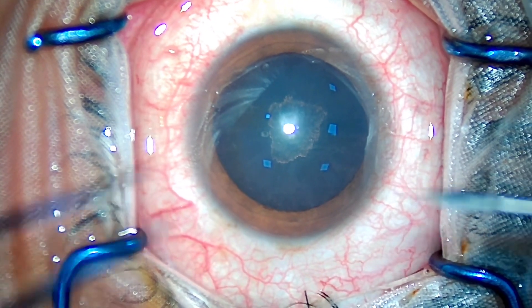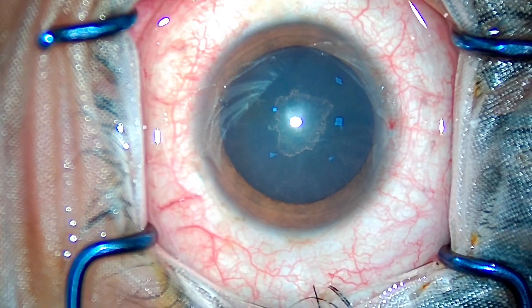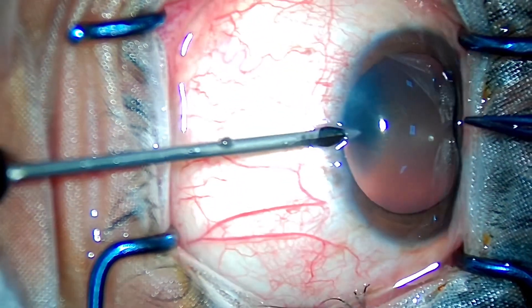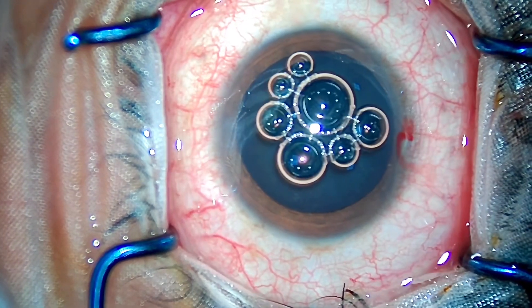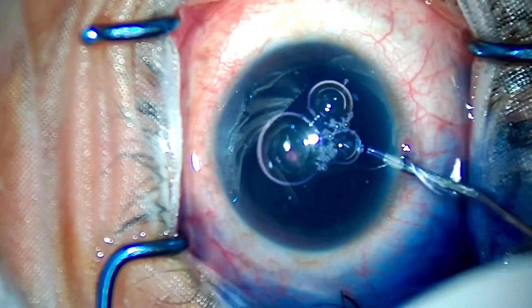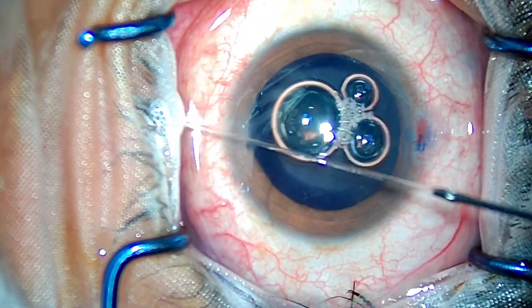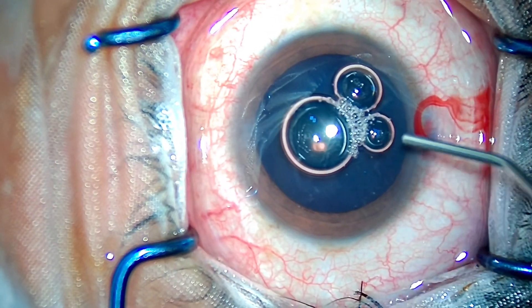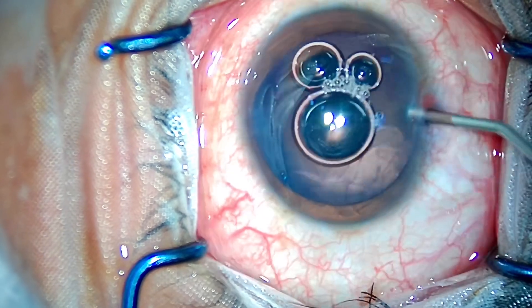Greetings to all my fellow surgeons. Hi, I'm Dr. Simanjil Goyal, and today I am going to show you a case of Synergy IOL implantation. I'm operating a 50-year-old VVIP patient who just got a renal transplant and was given high-dose steroids, due to which he developed posterior subcapsular cataract. Three or four key things I want to emphasize in this instructional video: the importance of an adequately sized rhexis, how to center an EDOF IOL like Synergy, and the importance of anterior capsular polishing.